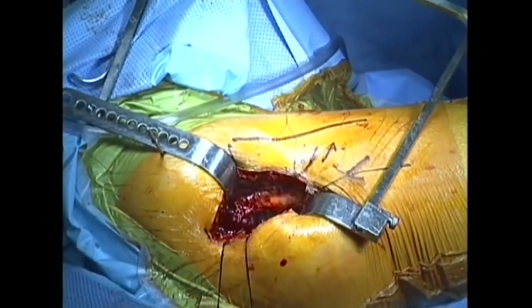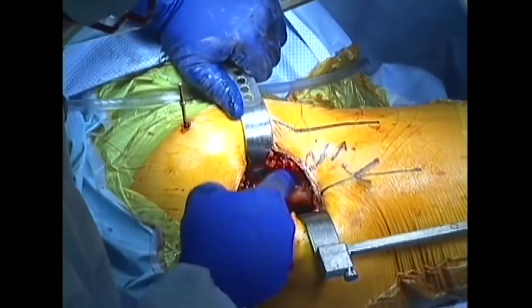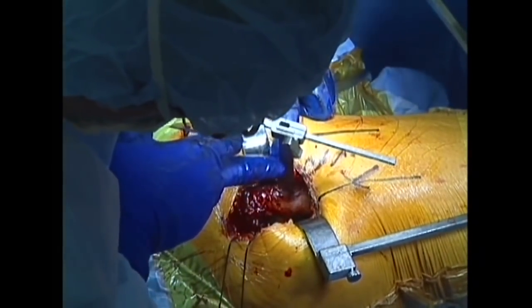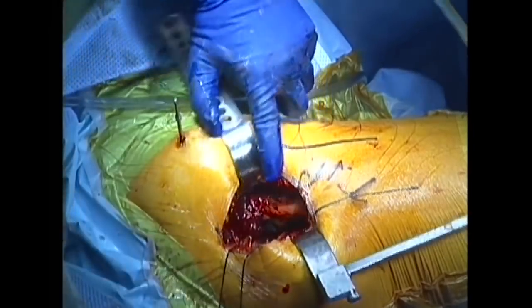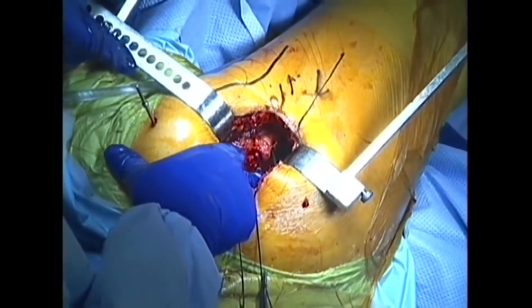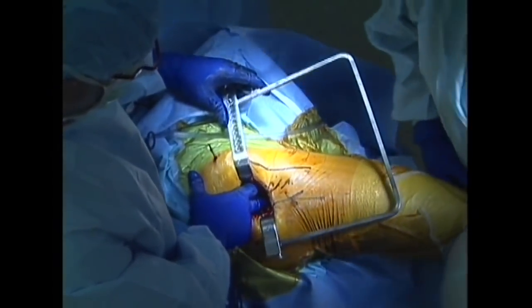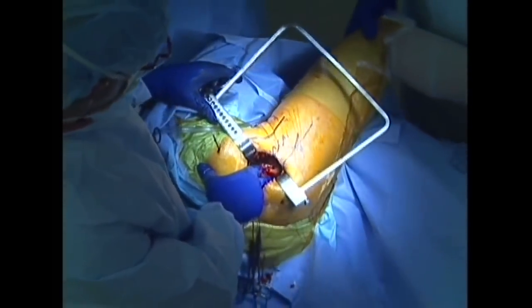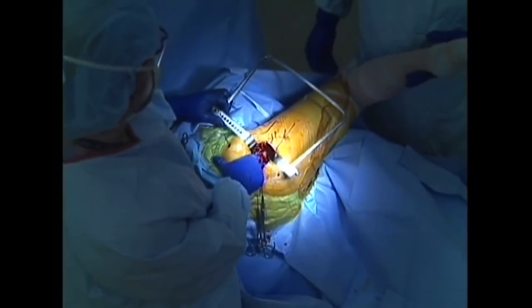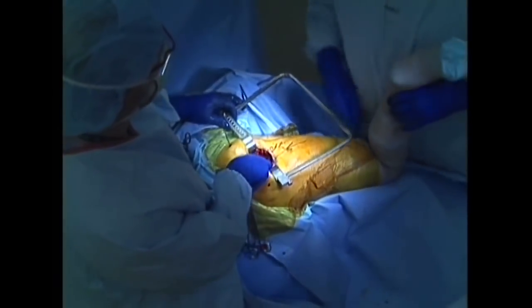The hip is evaluated to determine if the trial implant is an appropriate fit. Hip length is measured using the previously placed reference pin, and hip stability is verified with an examination of hip motion. The hip is then dislocated and the trial implant is removed.